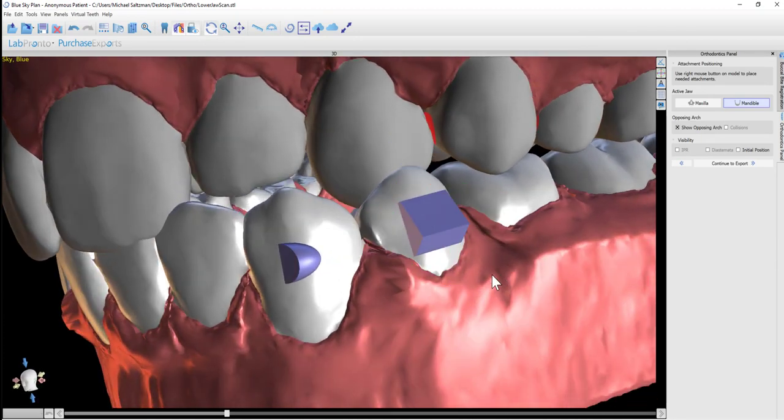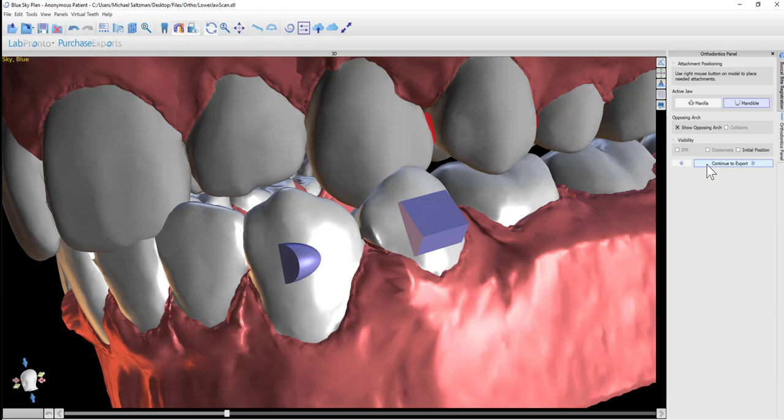Once you've placed all of the desired button attachments, click Continue to export.